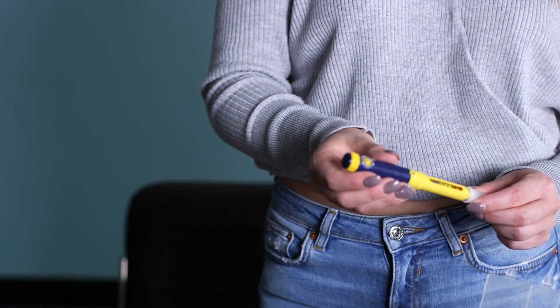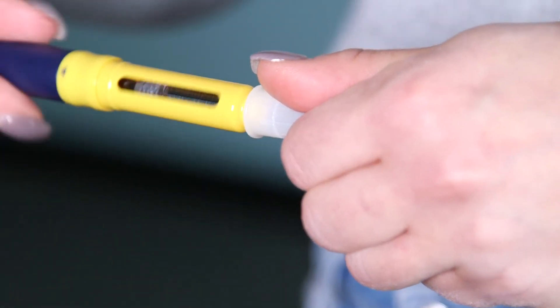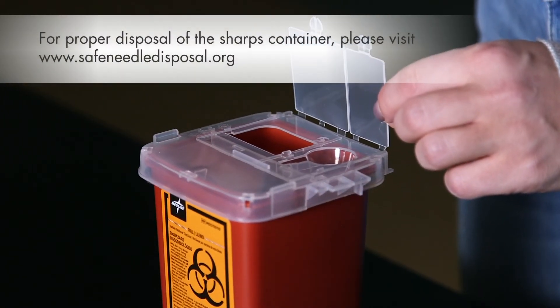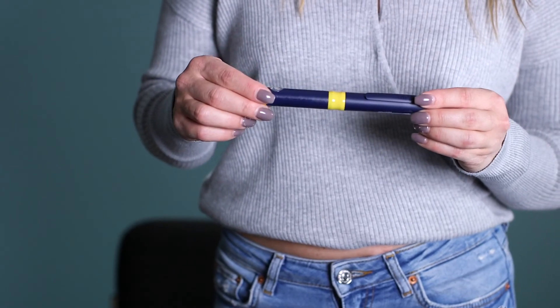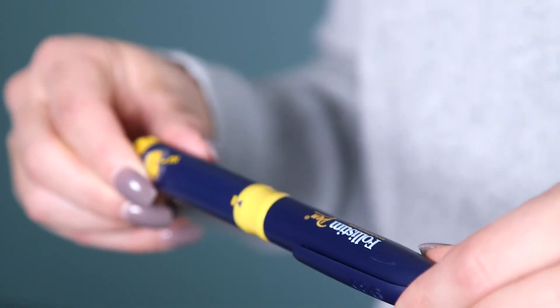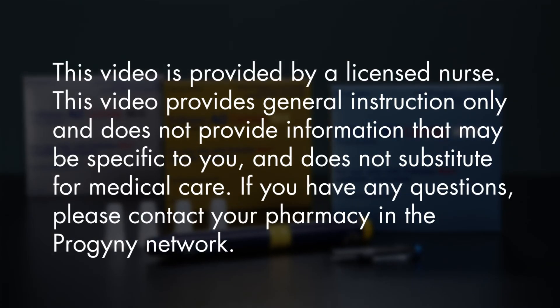The cap goes straight on, then grip the cap and twist the pen. The sharps container comes with a permanently sealable top. Open the lid, deposit the pen needle into the sharps container, and place the cap back on the pen. The cartridge within the pen can be kept at room temperature for up to 28 days from the date of its first use. If you have any further questions regarding your medications or protocols, please call your doctor's office or the pharmacy where you received your medications.